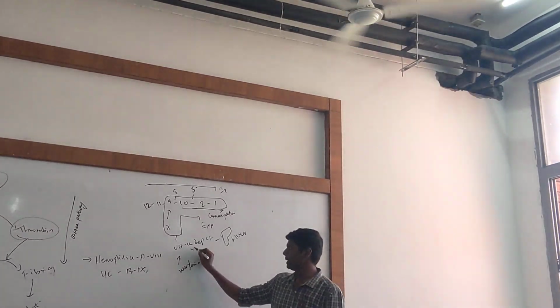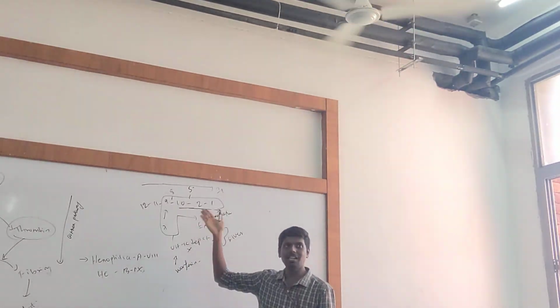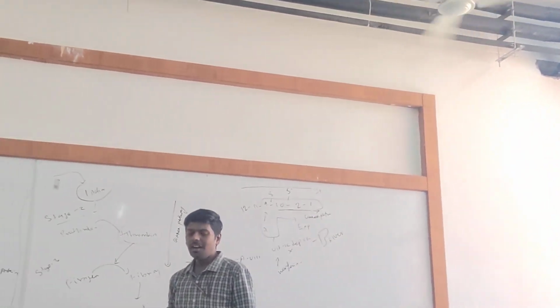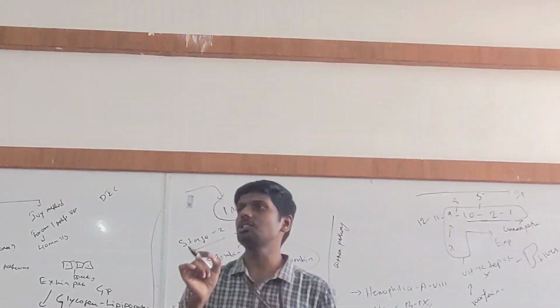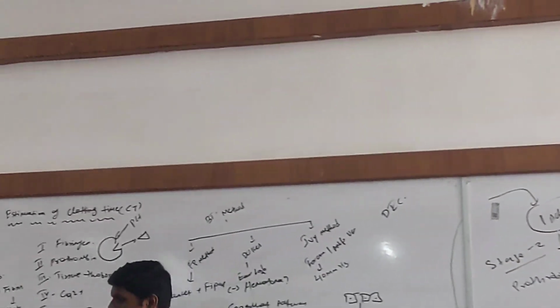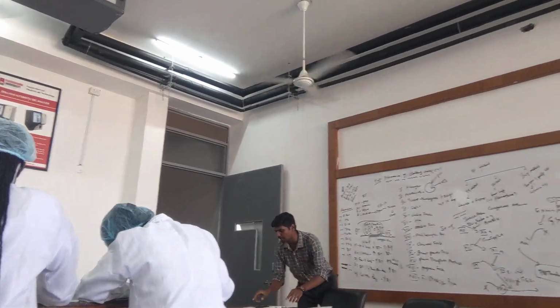Warfarin will destroy vitamin K, leading to absence of these clotting factors, leading to no clotting, increased clotting time. Right? Now write down the clinical significance of increased clotting time.